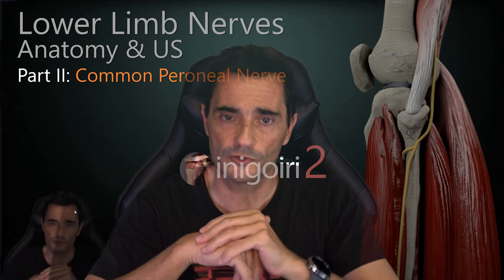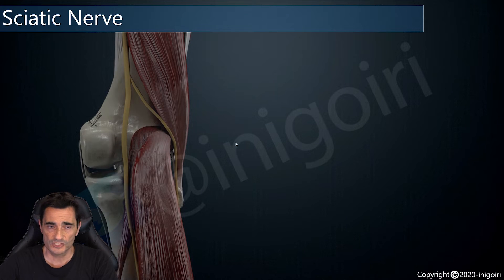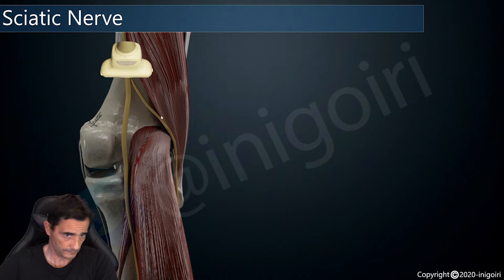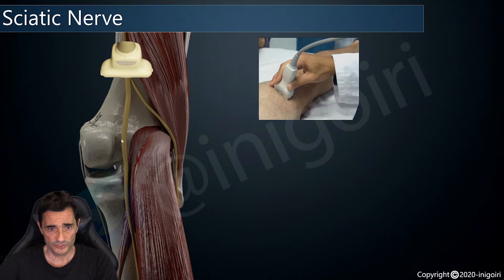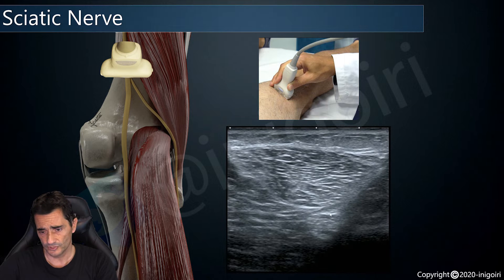In this video we will talk about the common peroneal nerve, also called the common fibular nerve. As a small reminder, the sciatic nerve divides at this level into its terminal branches: the tibial nerve, which is more medial and bigger, and the common peroneal nerve, which is more lateral. We will place a probe at the popliteal fossa just proximally.